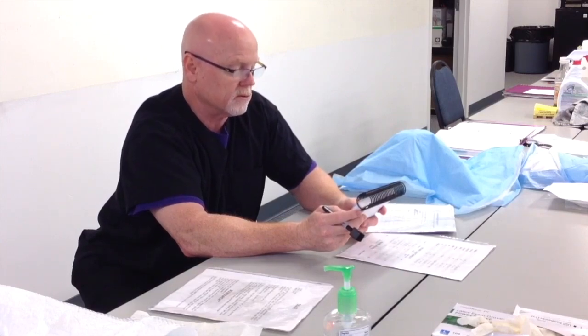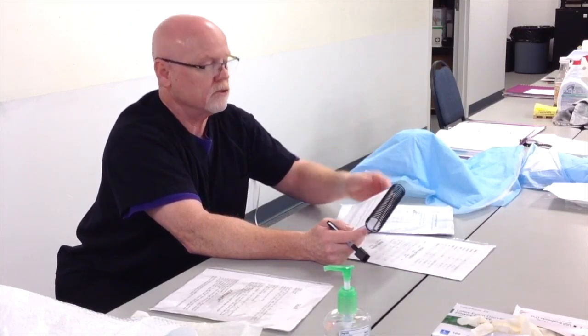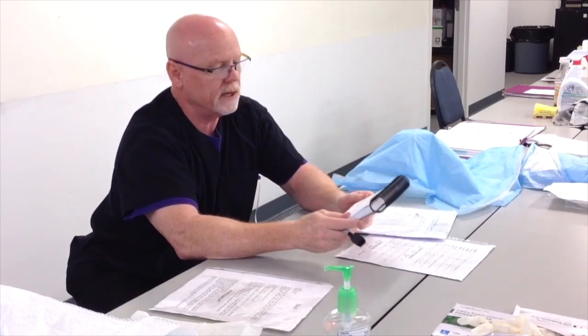And just to kind of give you an idea of what the clinical notes may look like, you could say at 16:30 bladder scan revealed 240 mL of retained urine in the bladder. Per doctor's order, sterile intermittent catheterization performed with a 14-French catheter. No resistance noted during procedure. Now, there was no urine there, right? So there's no reason to chart urine. So that's kind of an example or a sample of what you would chart if you were to do this task right here.